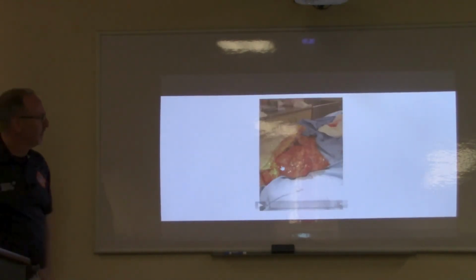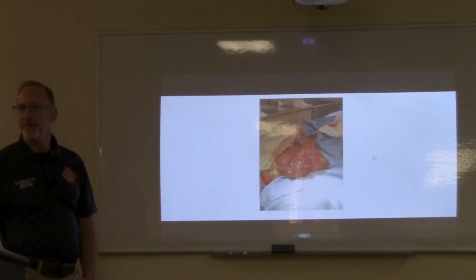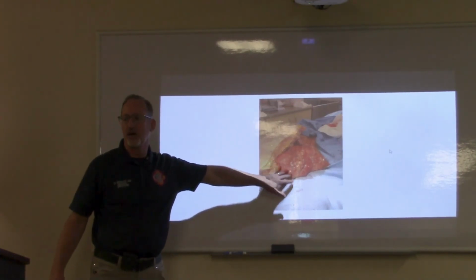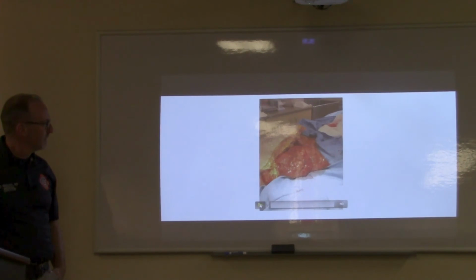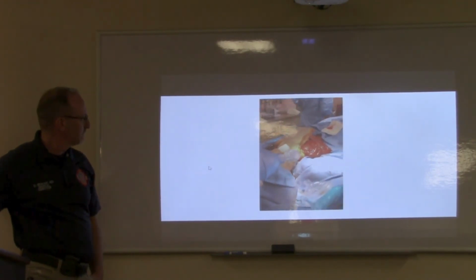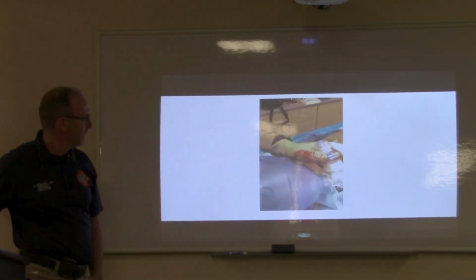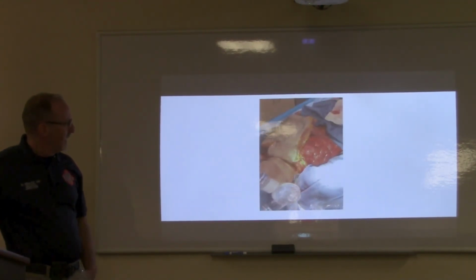So this is a nice video that we took in the anatomy lab at UNM. And the patient didn't do so well, as you can imagine, right? But this is an open chest, right? So you can see lung. And here, we're going to take a little break from the cadavers and show the PEEP valve. So that's how the PEEP valve fits on the exhalation port.